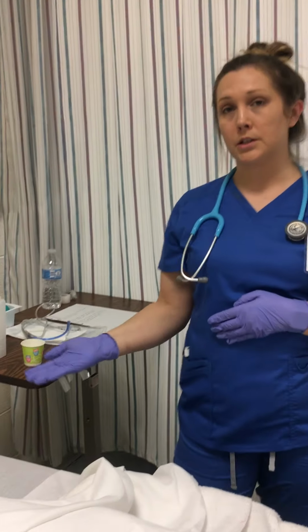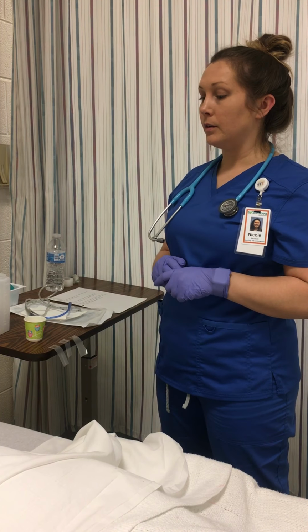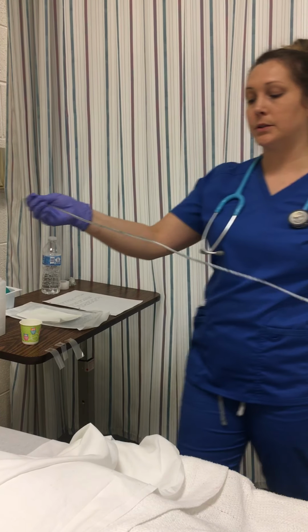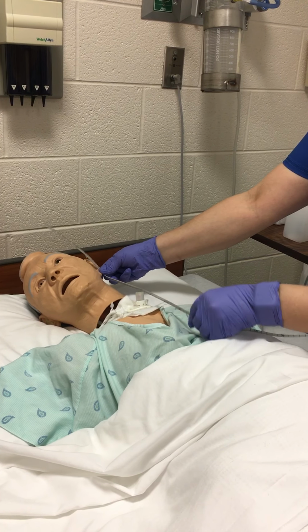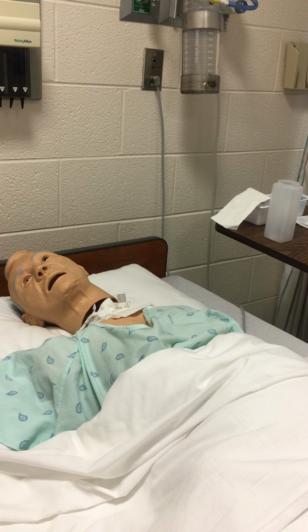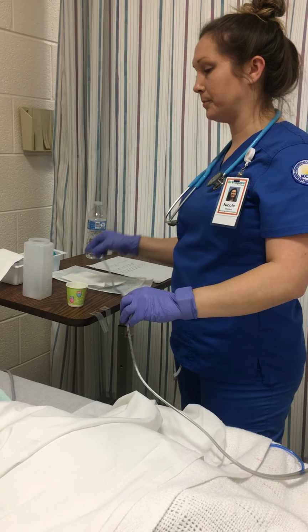At this point, the patient's going to be in a high Fowler position. This bed is not able to demonstrate that, but it will be in a high Fowler's position. Once I've assessed, I'm going to measure my tubing. So first I'm going to start at the naris, go to the earlobe, and then from the earlobe go to the xiphoid process. I'm going to take that off, and then I'm going to lubricate my tubing.